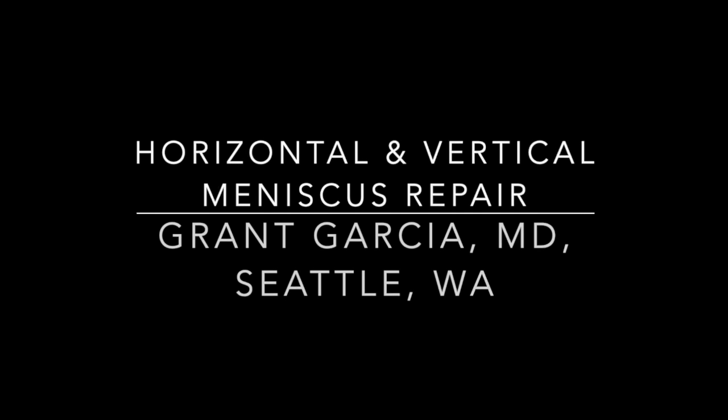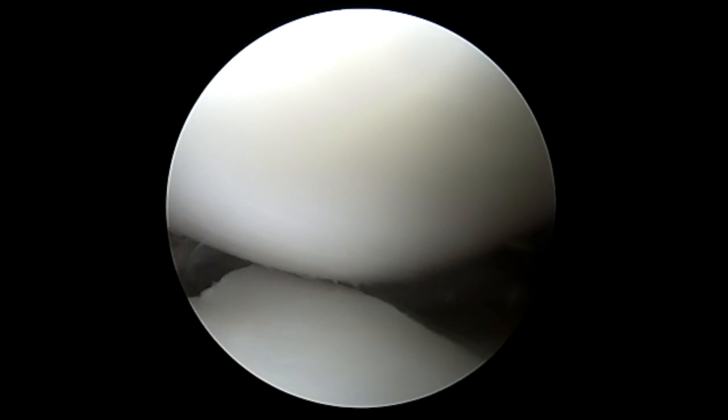Today we're going to demonstrate our technique. This is a more complex meniscus repair in a young patient with a bucket handle tear, in addition to a horizontal component to the capsular portion of the tear. You can see here this bucket handle tear has been reduced now.